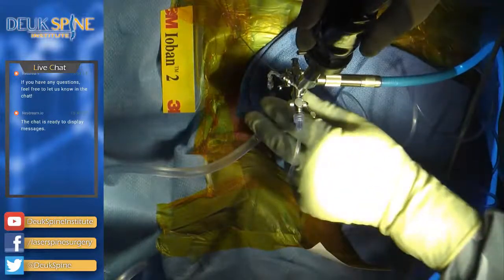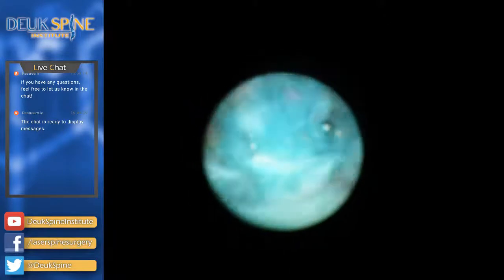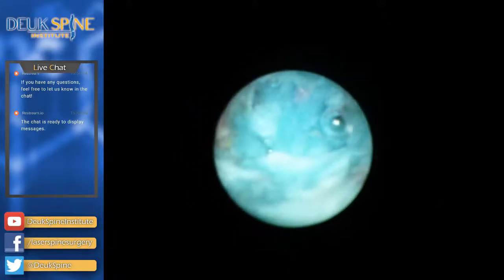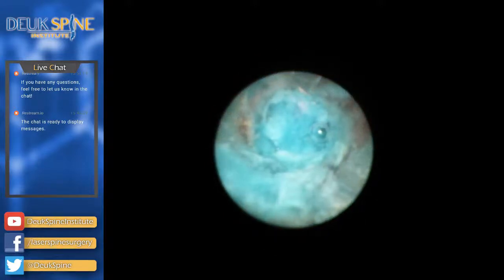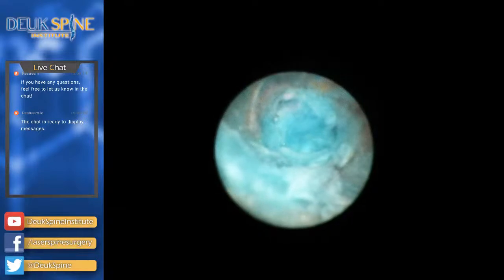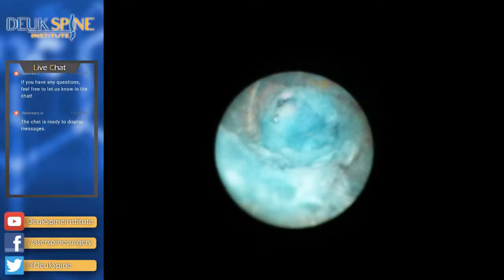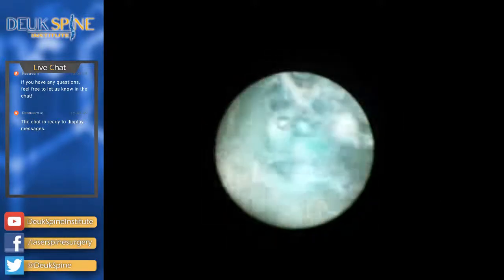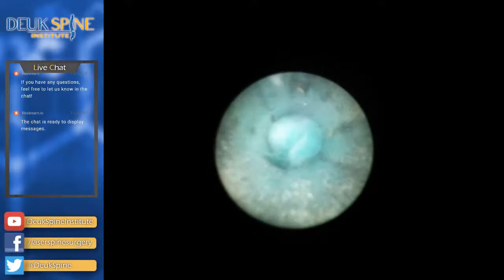Okay, here we go. Lights down. We are just inside the herniation right there. You see that? So I'm going to try to focus a little better. That's good. And then we're going to get started. Where's my pedal? We should be on 20. We are on 20. All right. Here we go. So I'm going to zap this herniation out of here. I need the light down a little bit. The intensity is too high.